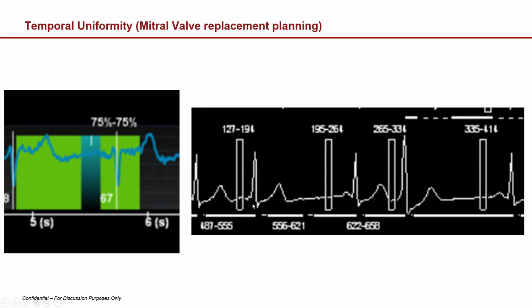Now, ideally, if you do have that arrhythmia, your system can be programmed to take a picture with the fast heartbeat and then take another one during the slow heartbeat, and then you can choose the one you like. This one's generally going to be easier to view because it's not moving as much.